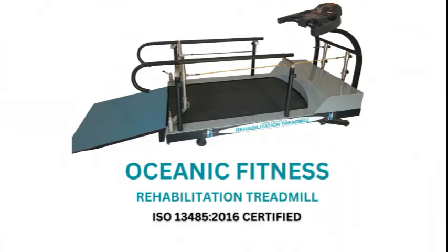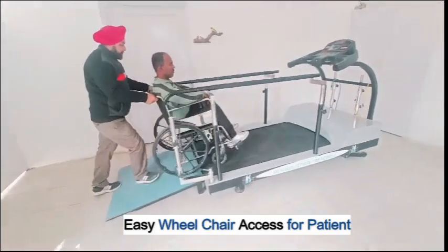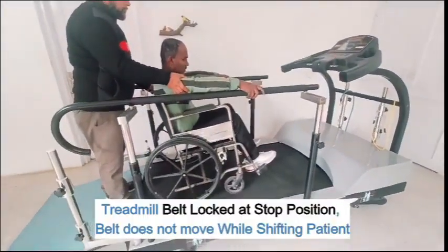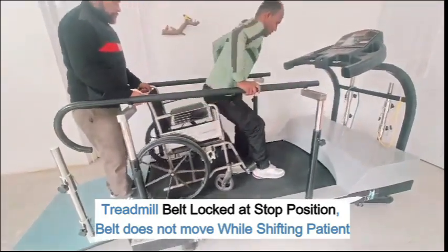Oceanic Fitness presents the Rehabilitation Treadmill, featuring easy wheelchair access for patients. The treadmill belt is locked at the stop position and does not move while shifting the patient.